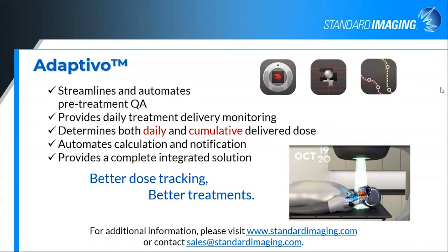I have one question here. Does the Adaptivo module have a deformable registration engine incorporated? Yes, it does. We have a Morphons algorithm that's used, and it is incorporated within Adaptivo. It runs automatically in the background when we're doing those cone beam calculations.